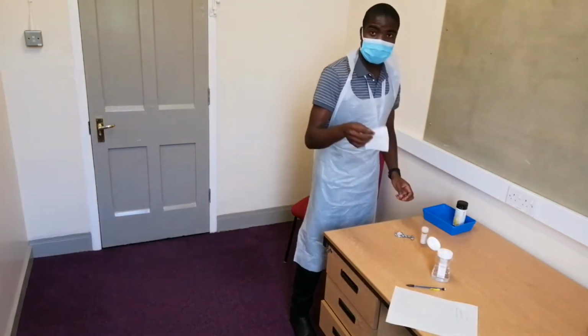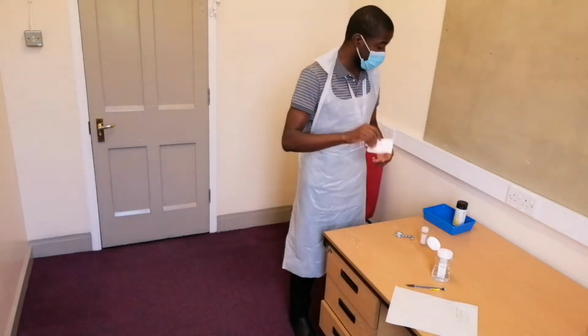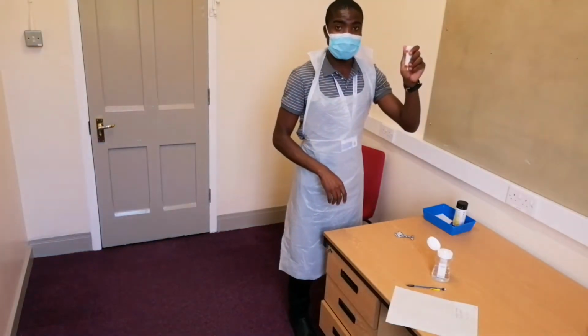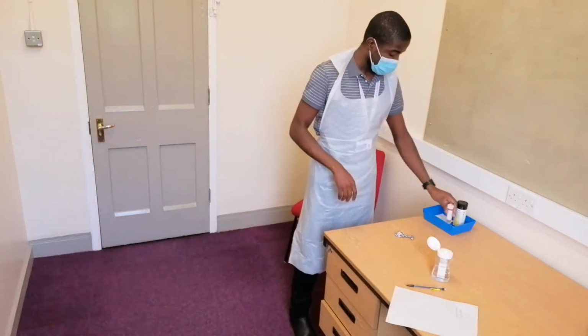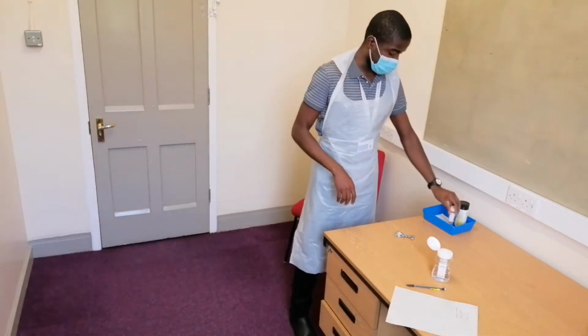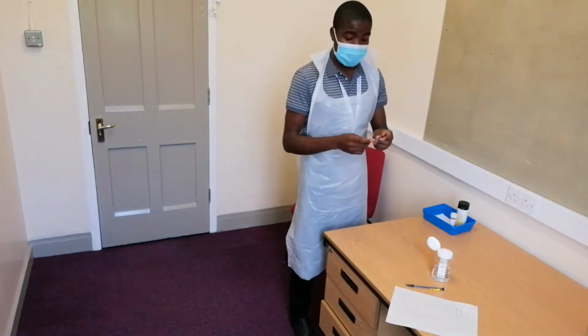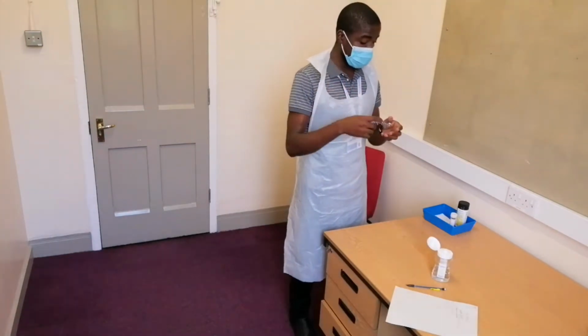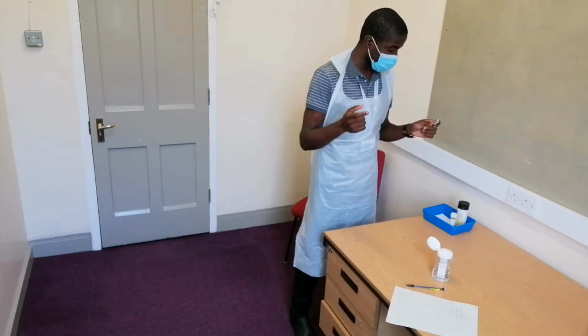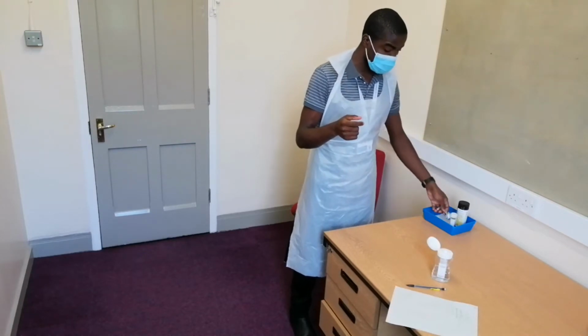I also have a dry tissue. Happy to use. I'll require an empty bottle to give to my patient with the patient details, and it's ready for use. I'll require a stopwatch to monitor my urinalysis strip.